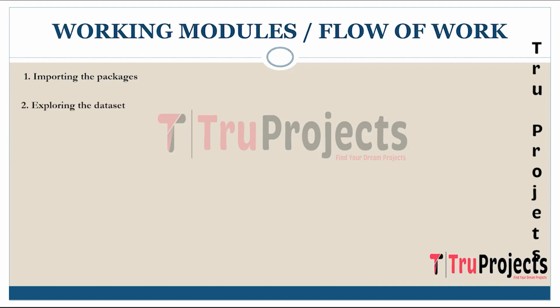Coming to the next step, which is exploring the dataset. In this phase, the iNet master dataset, which contains a collection of retinal images, is meticulously examined. Data exploration includes tasks such as understanding the dataset structure, checking for data quality, and identifying the types of retinal images and their associated labels. This preparatory step is vital for gaining insights into the dataset's characteristics.